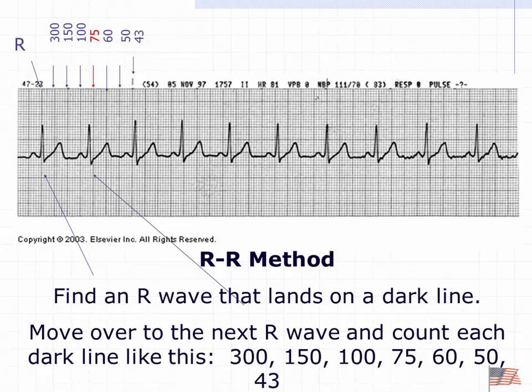Not necessarily. It's the easiest way, but it's also not as precise. It's the one we use when we have an irregular rhythm. That's regular, every R to R is even. That distance is that distance is that. You get somebody who's in atrial fibrillation, that's never the case, and you have to use that method. Okay? The first one. The next two are more precise because I'm using a much more precise measurement.